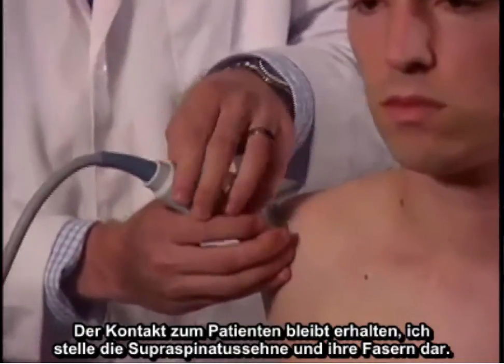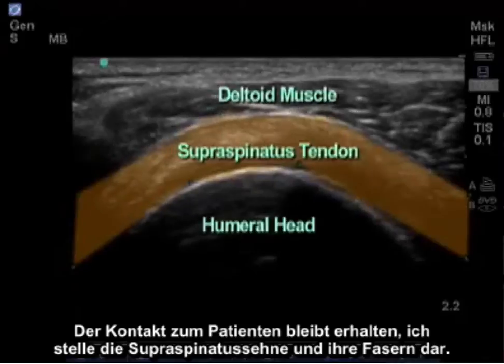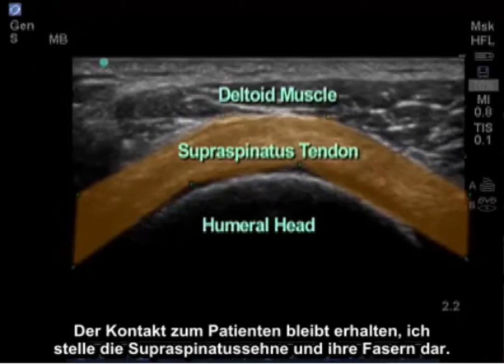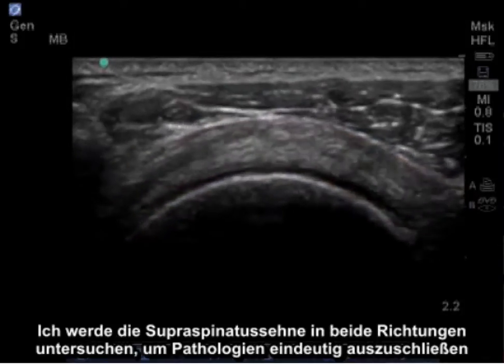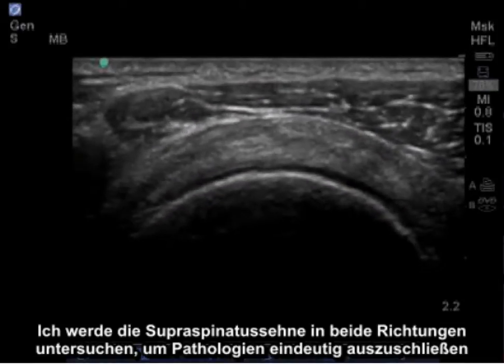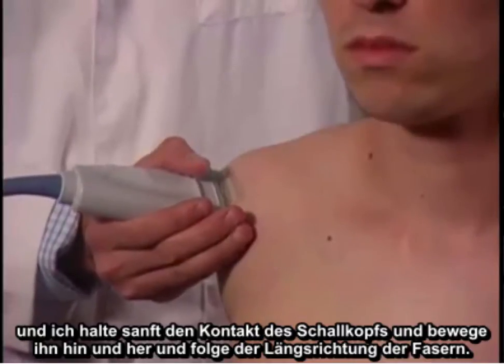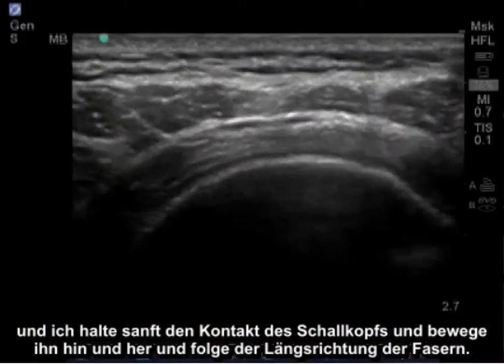Maintaining contact on the patient, I visualize the supraspinatus tendon and its fibers and I'm going to examine the supraspinatus tendon in both directions to clearly rule out any pathology. I'm gently maintaining contact and rocking the probe side to side following the length of the fibers.